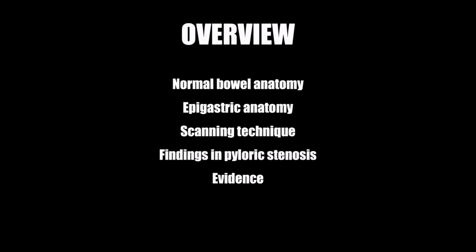As an overview for today's ultrasound lecture, we're going to discuss the normal bowel anatomy, the epigastric anatomy, review the scanning technique for pyloric stenosis, review findings in pyloric stenosis, and look at a little bit of evidence.